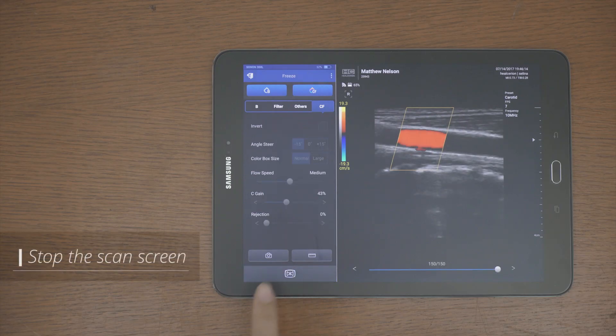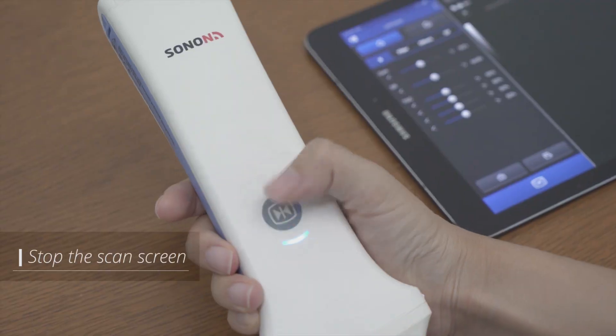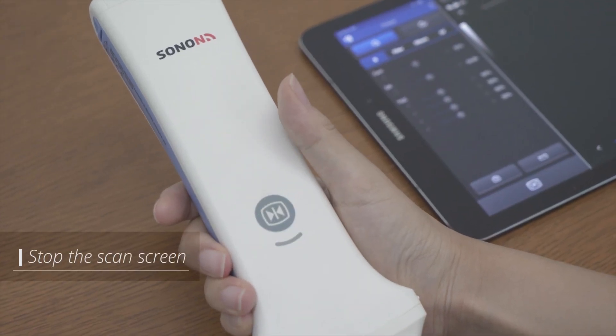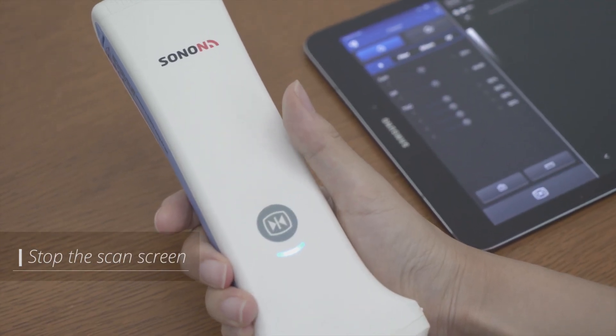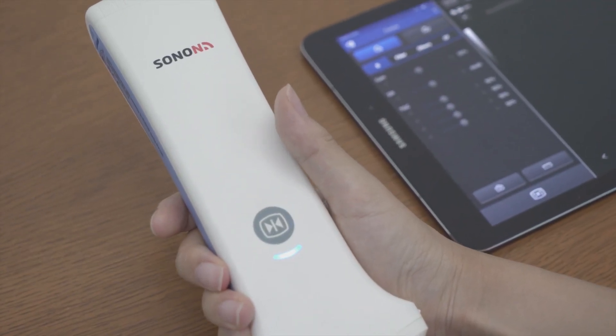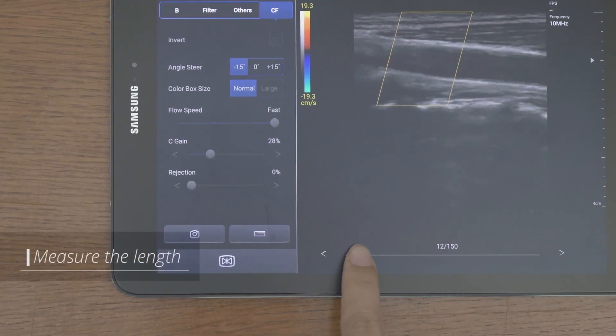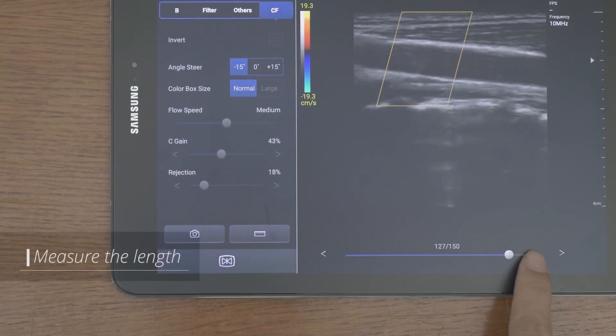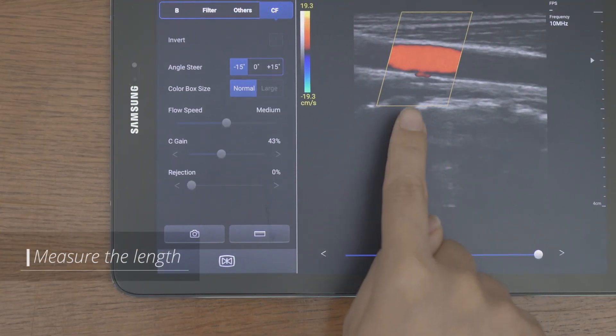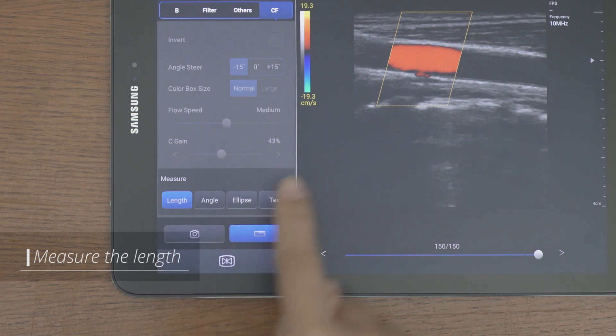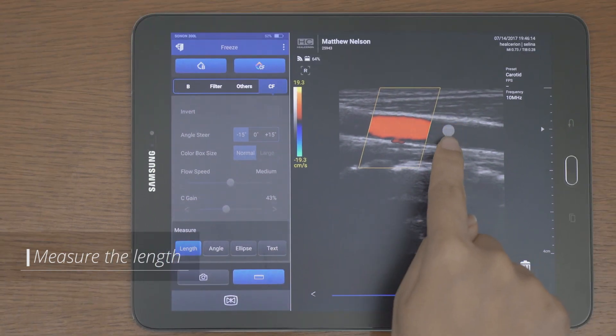You can stop the scan screen by using the freeze button in the app or the button on the front of the device. You can find the desired image and measure the length with the rewind bar, which stores the latest 150 frame images.